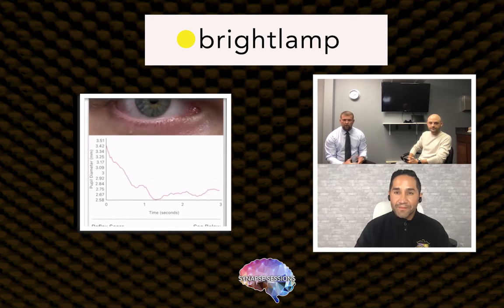We use it with our neuro patients to look at brain fatigue, but especially our concussion patients, where we can get certain data points like amplitude, velocity, 75% recovery time, and see if they're falling in a range of normal versus abnormal. And that helps us judge the state of their brain when they're starting, but then we do our rehab process and afterwards remeasure to see that they're back in range.